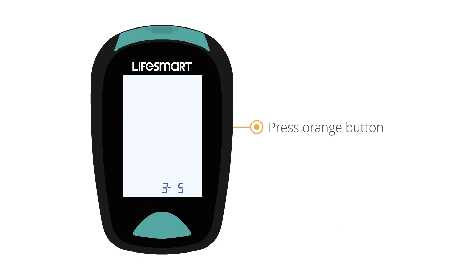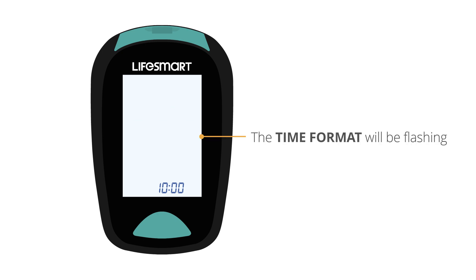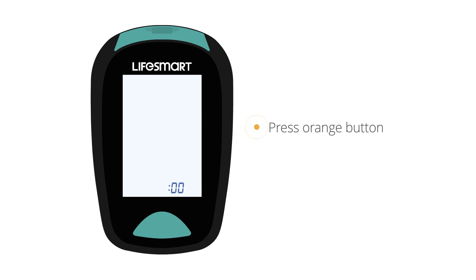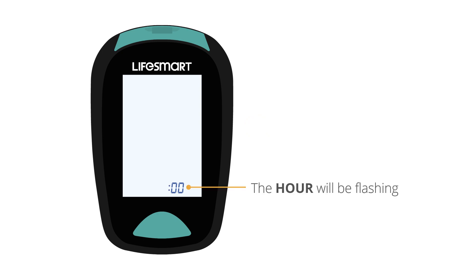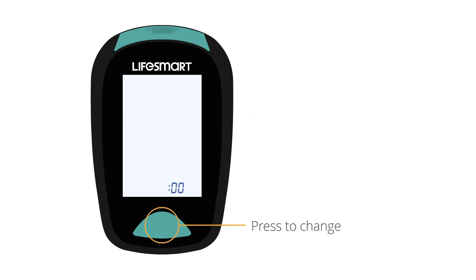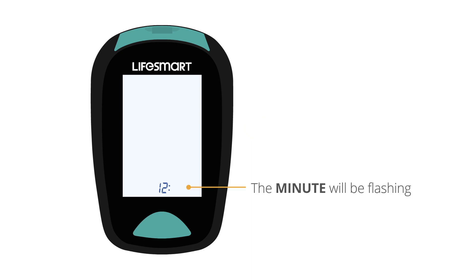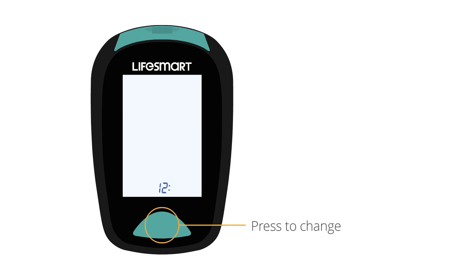Press the orange button again. The time format will be flashing — press the green button to change between 12-hour or 24-hour format. Press the orange button again. The hour will be flashing — press the green button to change. Press the orange button again. The minute will be flashing — press the green button to change.